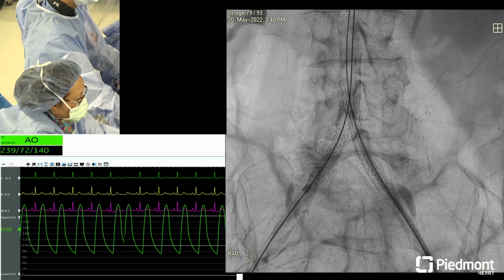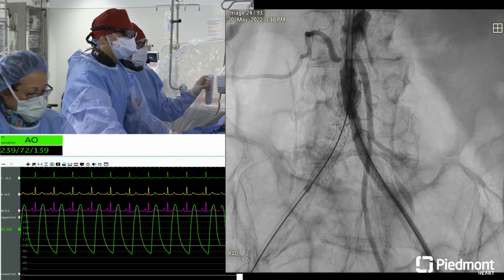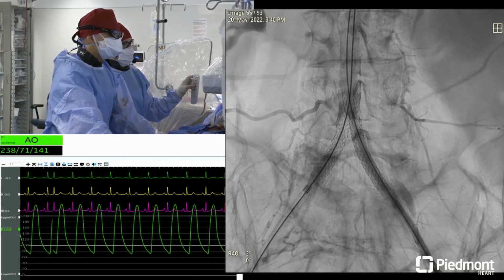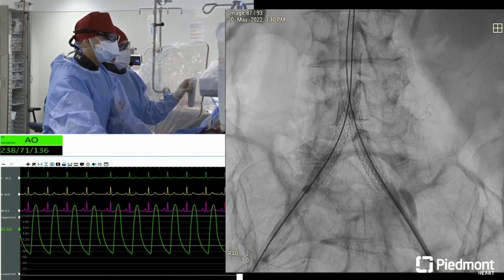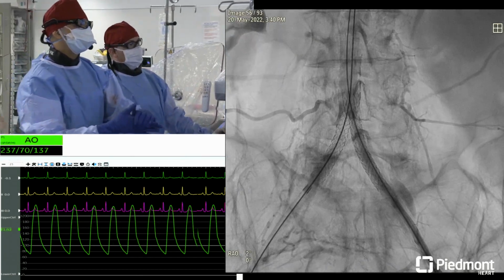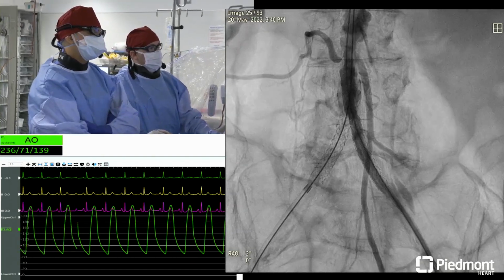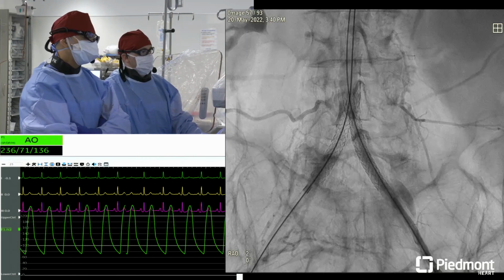I doubt the 8s are going to seal it either. I would say that, obviously, it's a judgment call to use the 8, but I think the reentry is just a little higher, so I'm pessimistic that it's going to change much with the 8s. Yeah, Jay, I think you're right. I think the re-entry was a little bit higher. So we'll have to think about exactly what we do at that spot, but you're probably right.